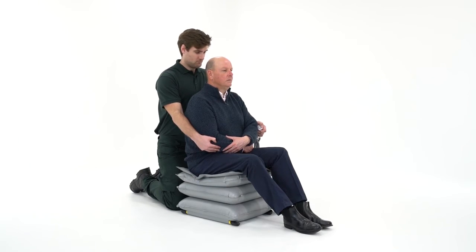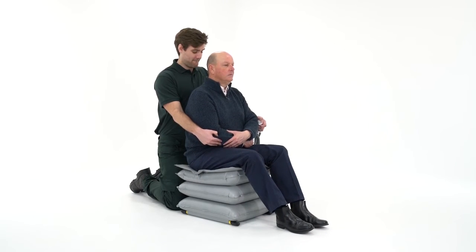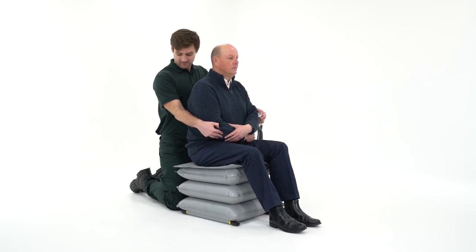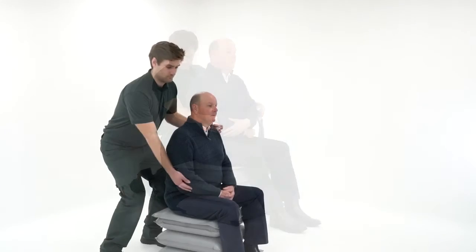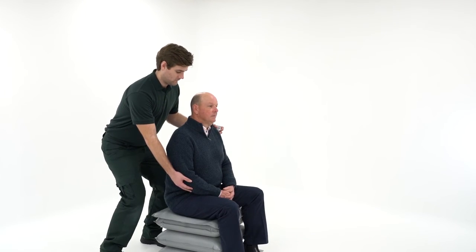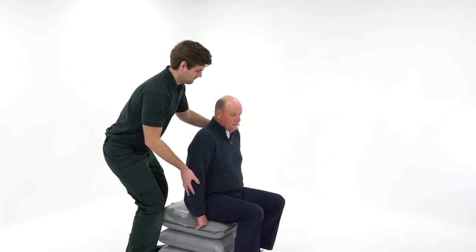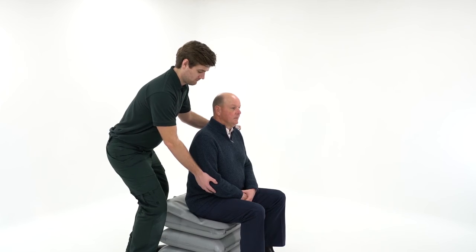Press and hold button 3 to inflate the third section. Three inflated sections will usually be sufficient to enable transfer, but a taller person may need all four. The paramedic will need to alter their position to maintain adequate control. It's essential that the person's feet remain on the floor at all times and transfer should not be attempted from a partially inflated section.